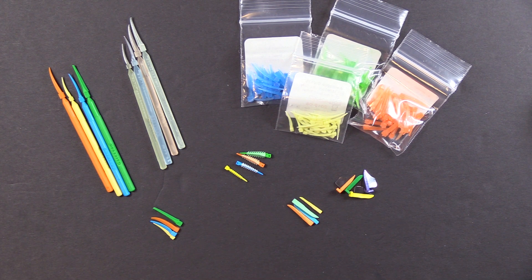Hi, everyone. This is Kevin with Garrison Dental Solutions, and we're tackling the top five questions for sectional matrix systems. This is question number five — all things wedge-related.